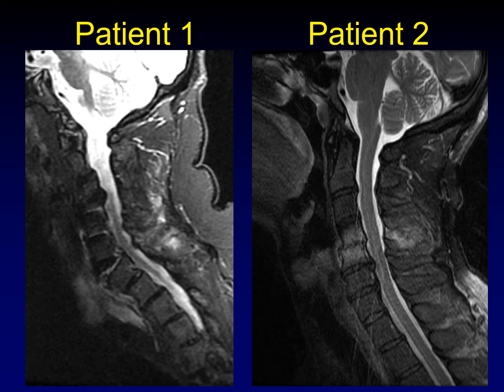What do they have in common? What we're seeing here is abnormal T2 signal within the central cervical spine, and you can see that there's abnormal T2 signal in front and behind the spine in both of these circumstances.